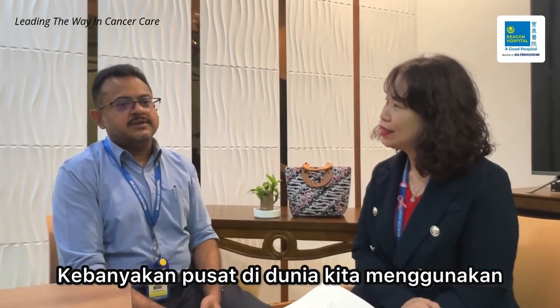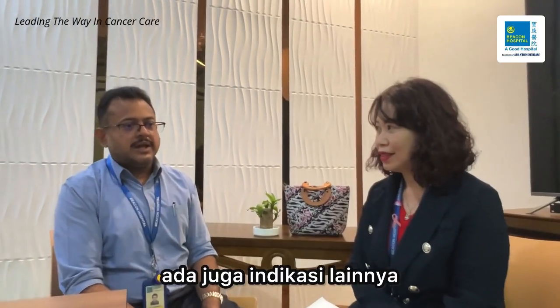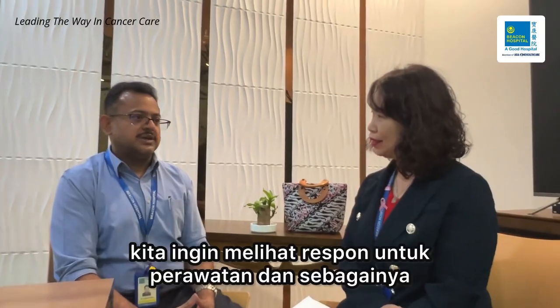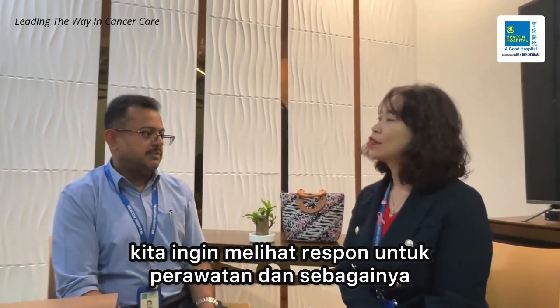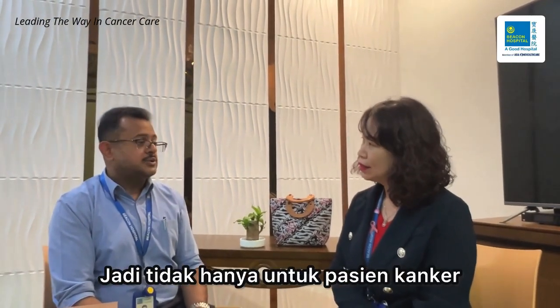Most of the centers in the world, we use PET scan mainly for patients with cancer, but there are also other indications for PET scan. For example, if the patient has any infection, we want to see the response to the treatment and so on. We can also do a PET scan.